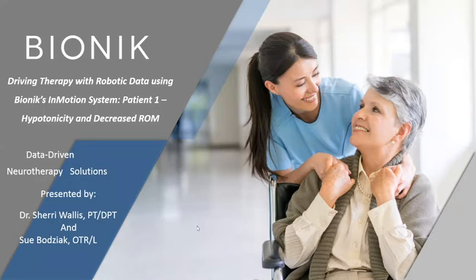Thanks, Kate. So welcome to the third program in our series. If you've participated in the first two, you've seen how we developed our devices and the research that has gone into the process of determining how to best use them, and then how to specifically address the problem of spasticity using robotics in rehabilitation.